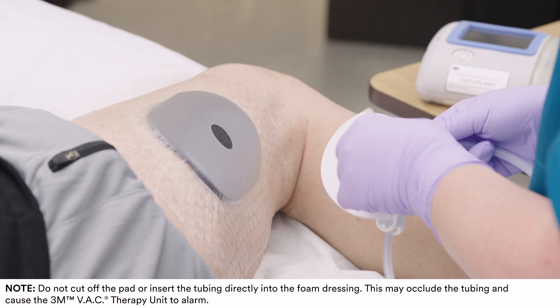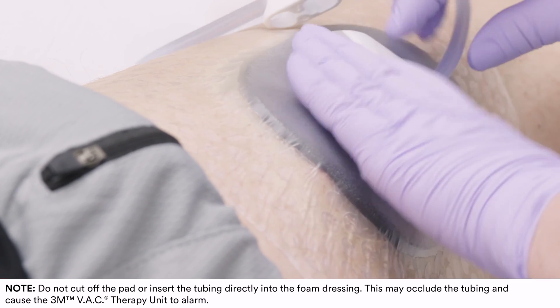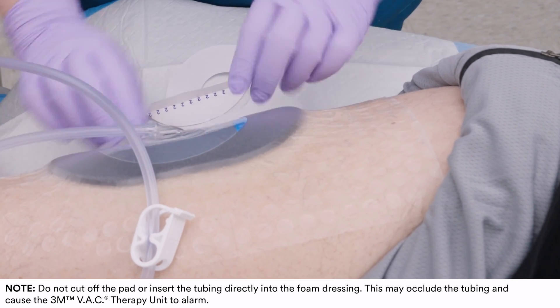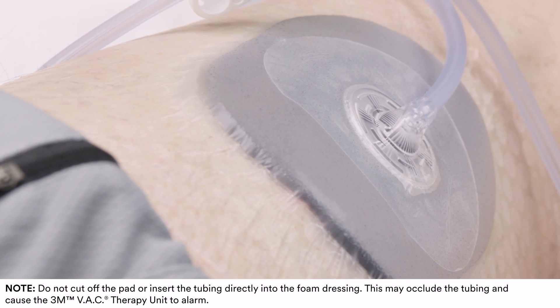Remove both backing layers and apply the Sensatrac Pad over the pre-cut hole in the dressing. Apply gentle pressure on the central disc and outer skirt to ensure complete adhesion. Pull back on the blue tab to remove the pad stabilization layer.